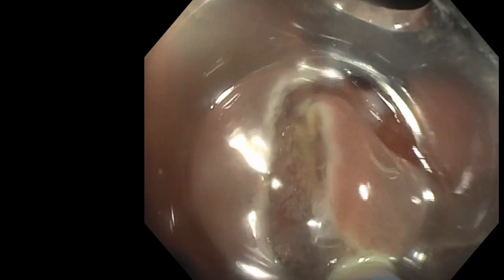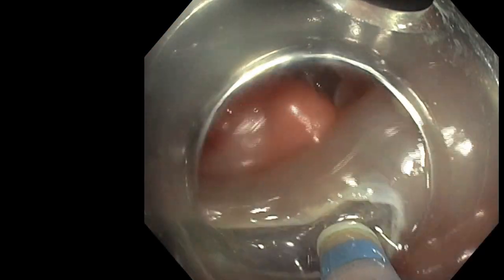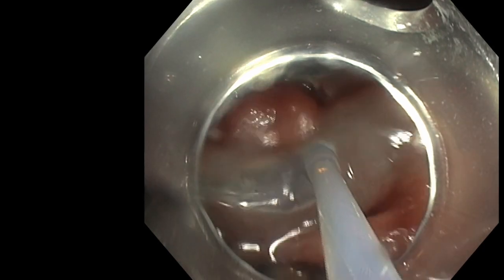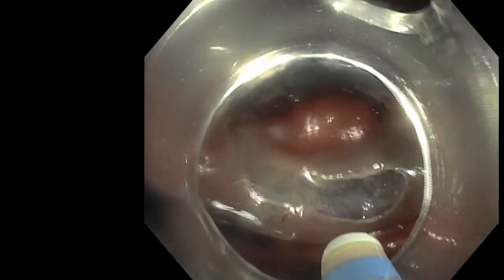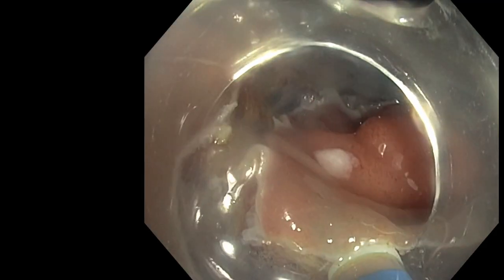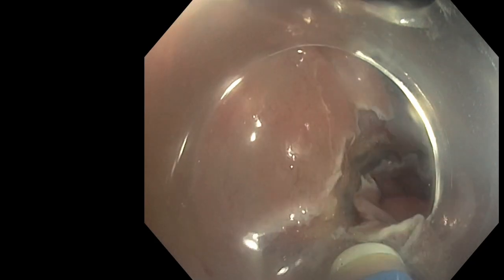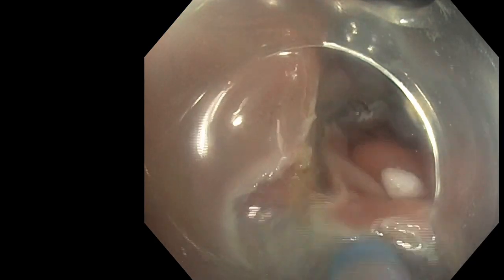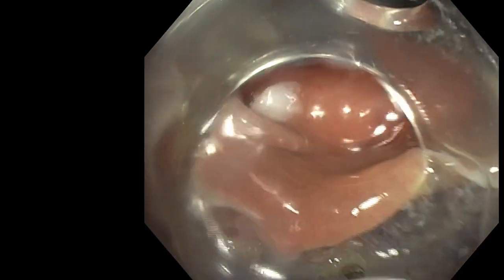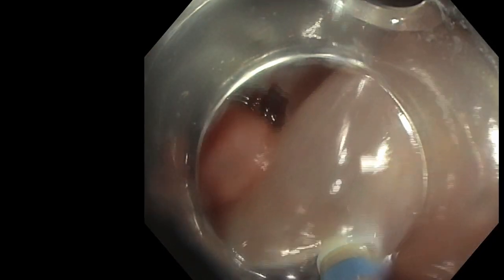So all the incisions are followed immediately by a trimming in order to get a good access to the submucosa immediately after the injection, because if you lose time, you will have a lot of leakage of liquid, because when you do your incision, you create a lot of leakage, and therefore the fluid injected in the submucosal cushion will go.